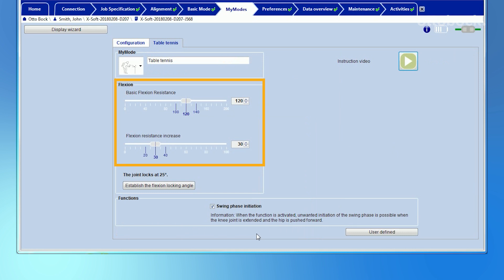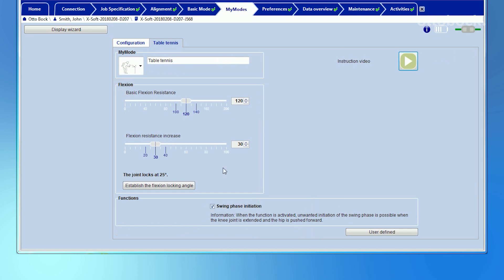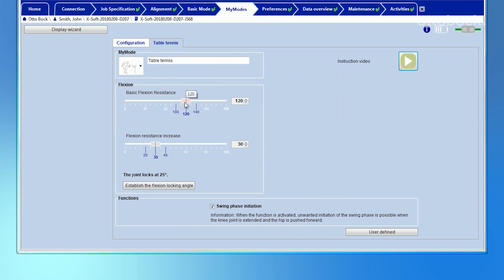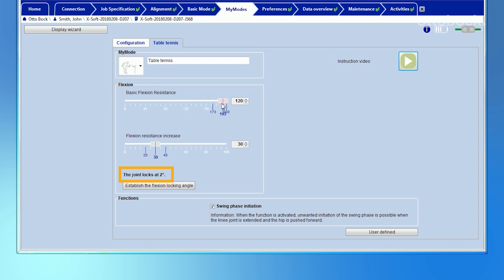Two parameters are now visible and their values can be easily changed. The first parameter is the basic flexion resistance. The higher this value is set, the higher the flexion resistance will be as the knee starts to bend. A higher basic flexion resistance will also decrease the flexion angle achieved. Conversely, if the basic flexion resistance is reduced, the maximum flexion angle will increase.